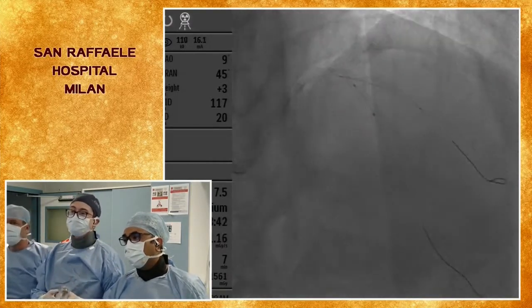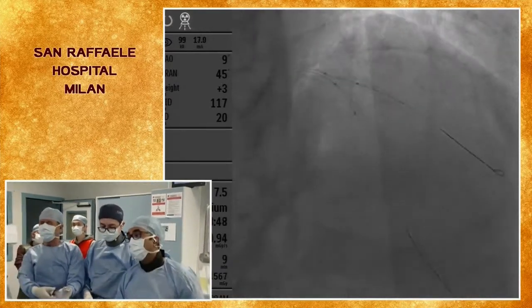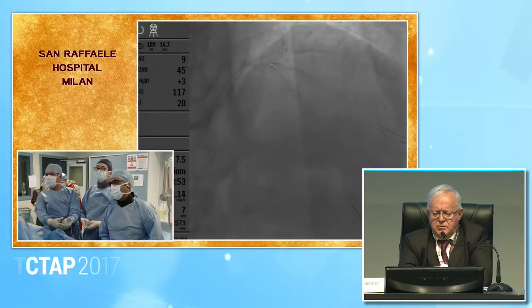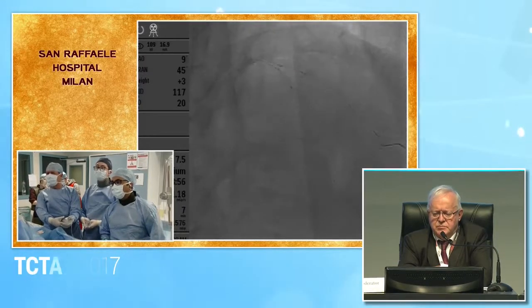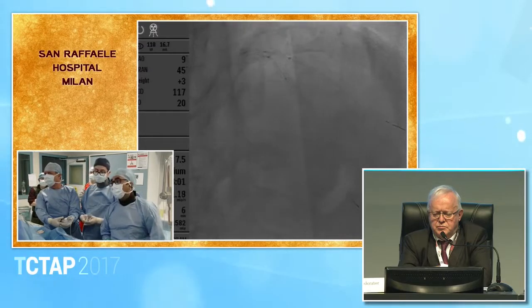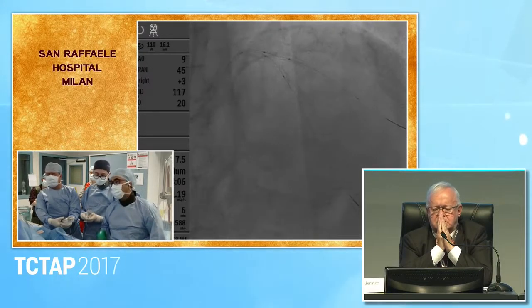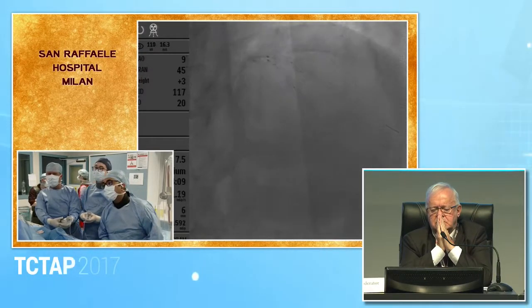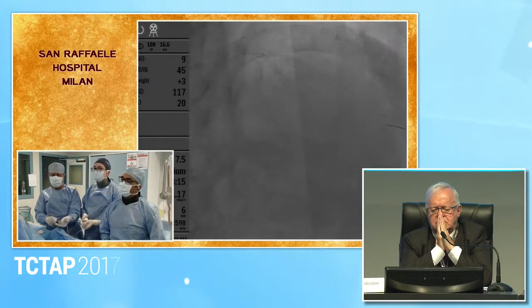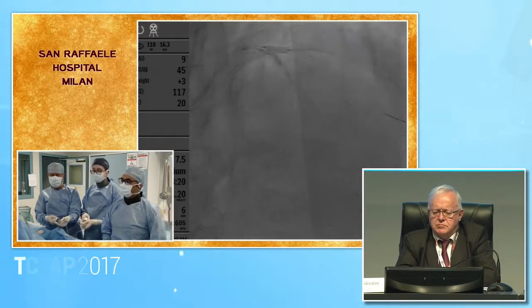Yep. We see. Okay, so this is 3.0 and 3.0. This is double. Yeah, it's two 3.0s. Two 3.0 NC. I know that the LAD is 3.5, but I'm worried about dissecting it if I go 3.5 towards the LAD. Which one's the LAD? Yeah. This one. Okay, let's just get the LAD back a bit. Okay, let's go. And play both together. Six, eight. Eight.